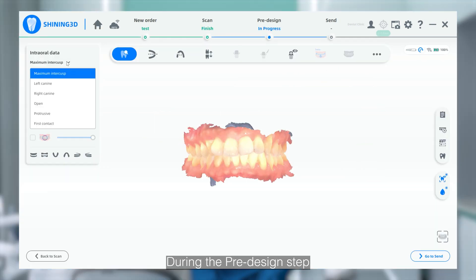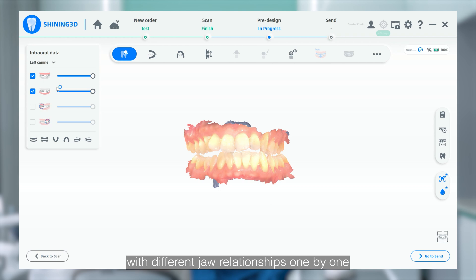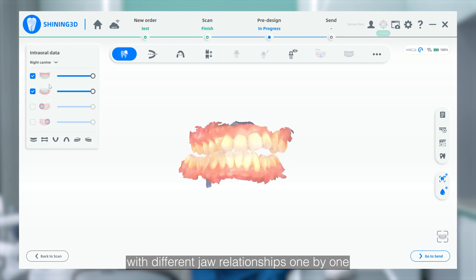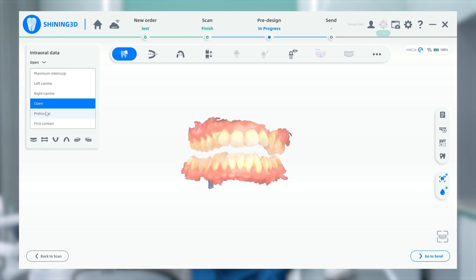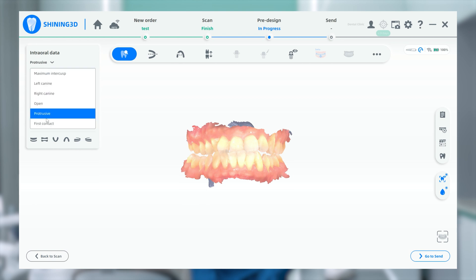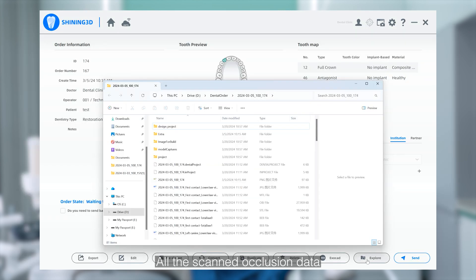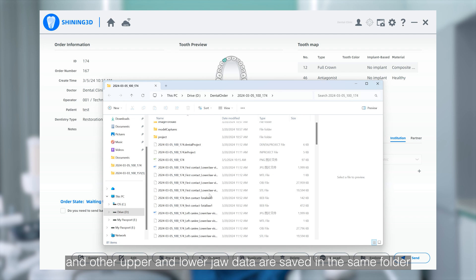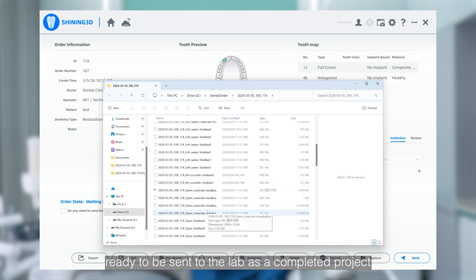During the pre-design step, we can review the occlusion information with different jaw relationships one by one. All the scanned occlusion data and other upper and lower jaw data are saved in the same folder, ready to be sent to the lab as a completed project.